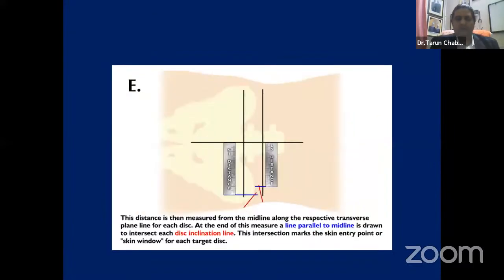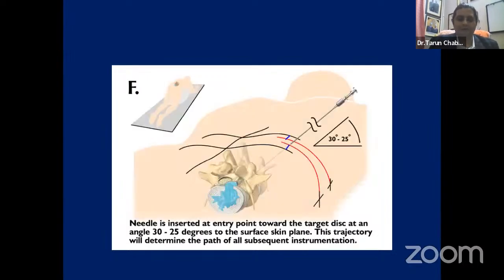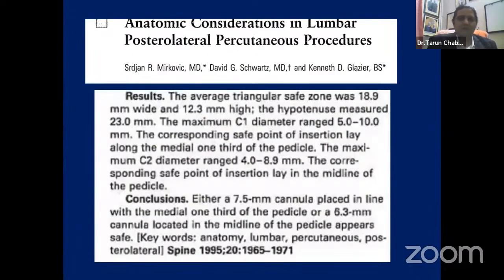The most practical slide is this for the needle entry, where these lines intersect. Then almost the distance is 12.5 centimeters. That is the safest distance in a study done in Indian patients. So we can trajectory at 25 to 30 degrees, but this anatomy can vary from patient to patient. So with experience, we can know the trajectory. In obese patients, we have to go more, the angle has to be increased. So this is a very good study done on cadavers. So 96 foramens were studied.